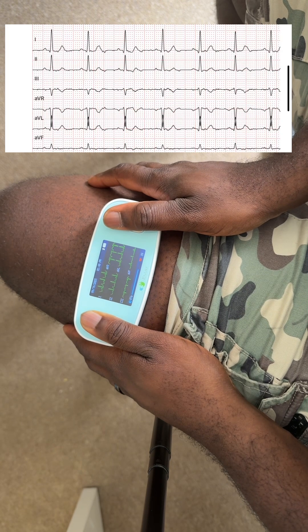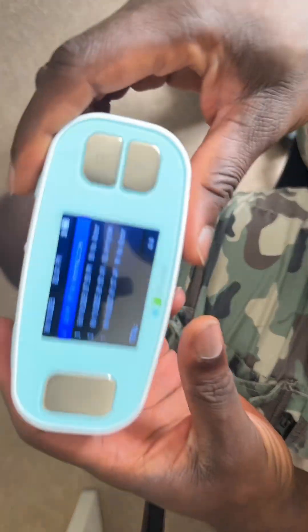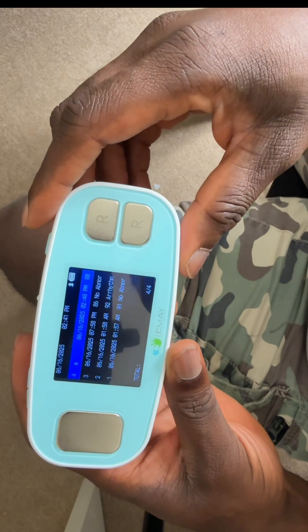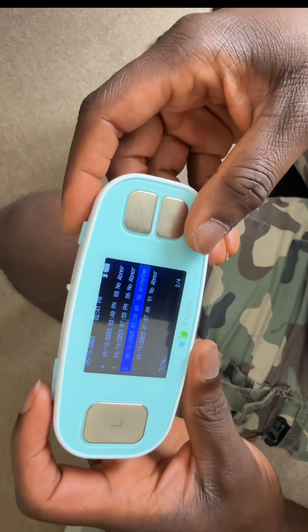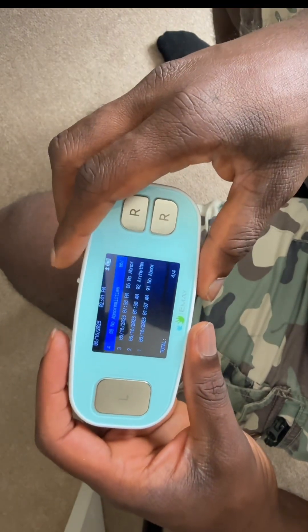It's counting down — seven, six, five, four, three, two, one. You can see clearly written there: no abnormality detected. No abnormality detected.